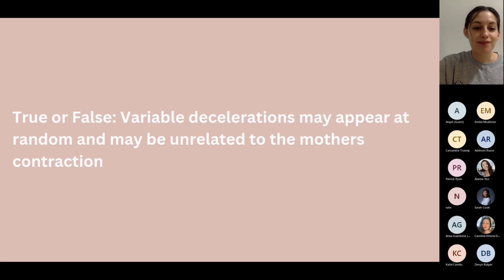All right. So true or false, variable decelerations may appear at random and may be unrelated to the mother's contractions.